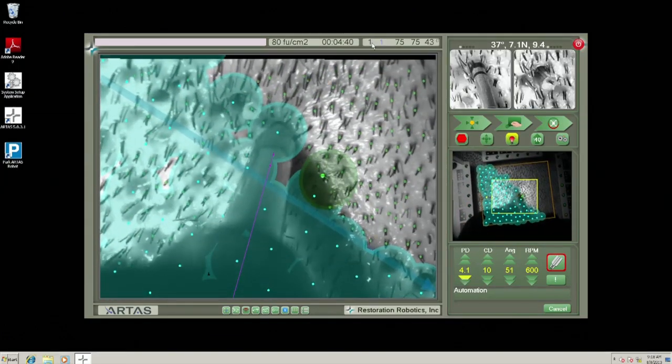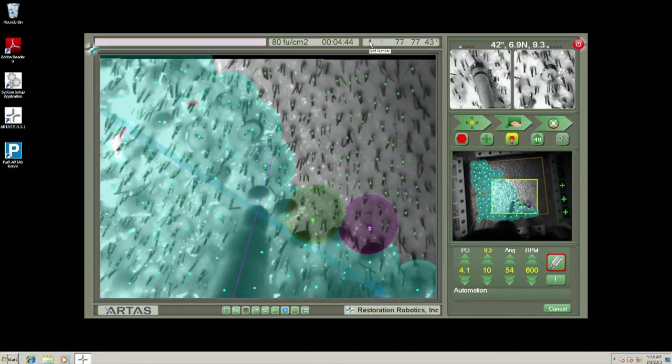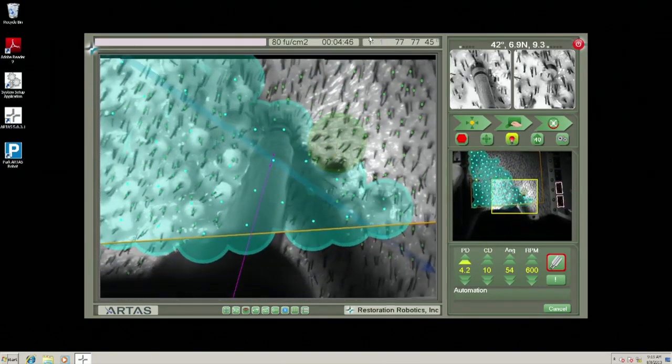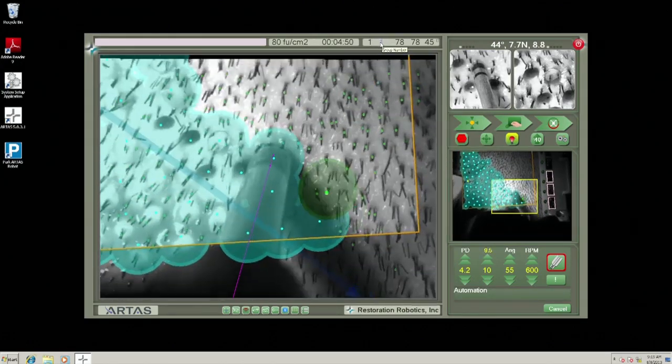Over here we have a number. We have the number 1 listed. That's the grid number, the number of grids that we've actually reacquired on, and this is the group number that we're on.